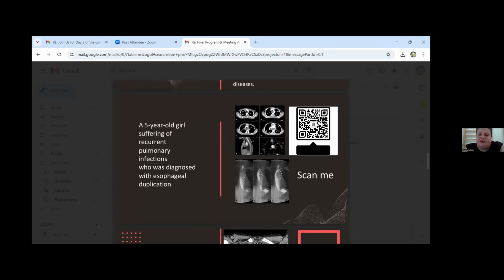This examination is performed with fluoroscopy, giving the patient oral contrast enhancement. You can see the deformation and the obstruction that the esophagus can have in this situation, and the duplication, which is the cystic structure without contrast enhancement, and the mass effect that this cystic formation gives to the esophagus, and to the trachea also.